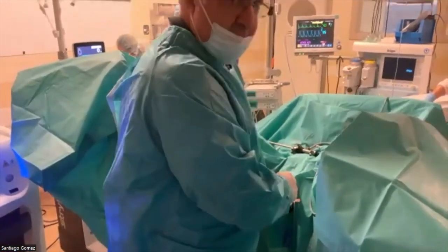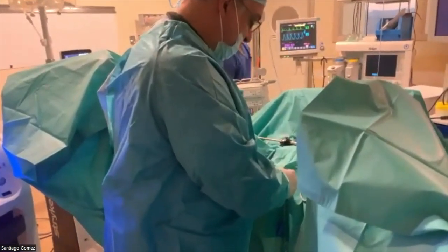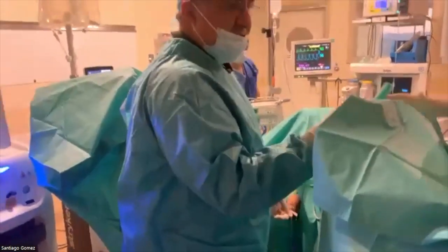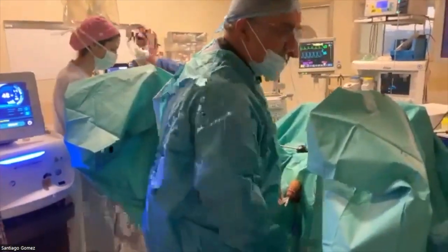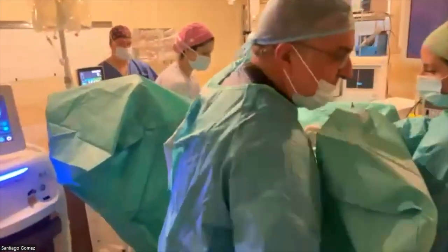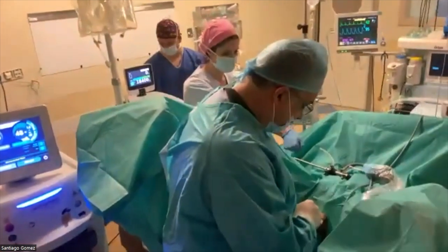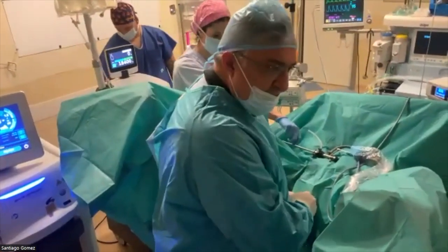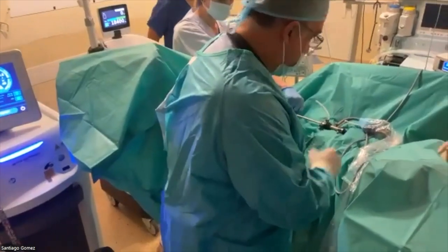Vamos a poner 60 en el balón. Good. So the case was slightly more difficult in the left side because I saw that tissue there, which was quite sticky. But at the end, we managed to do these cases in a reasonable time frame. Normally under 1 hour.